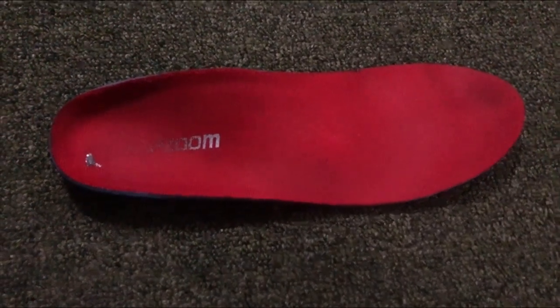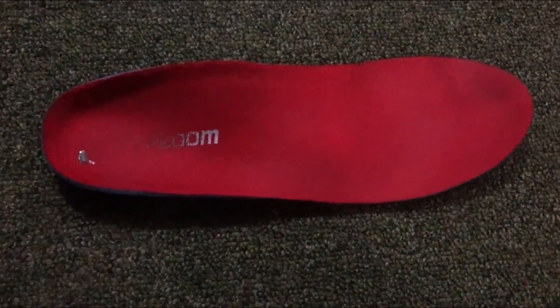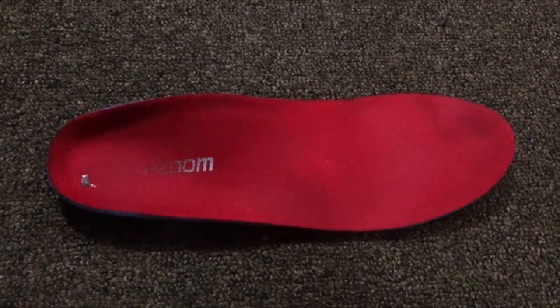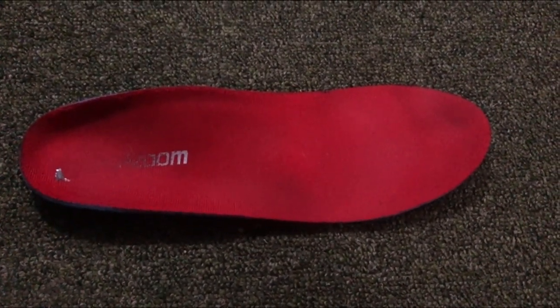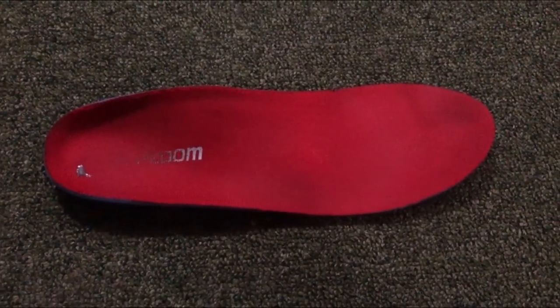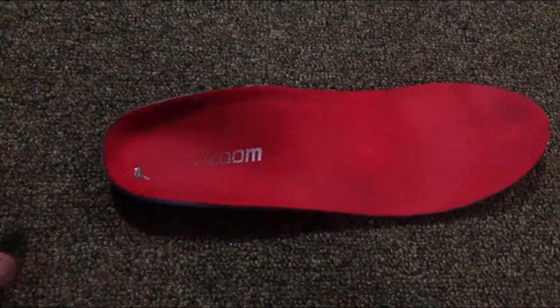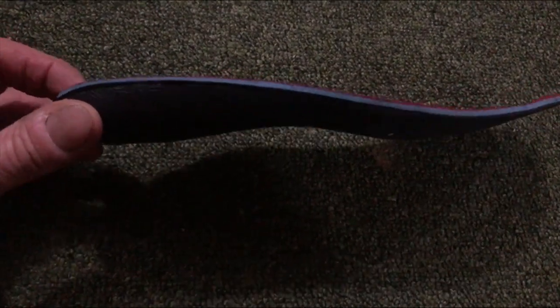This is a review on an insole for plantar fasciitis. I've done one before on another brand — that one is in my work safety boots right now and does a really good job. This one here is made by a brand called Pop Zoom.